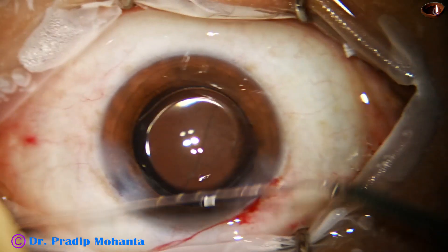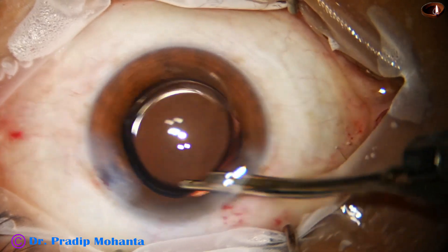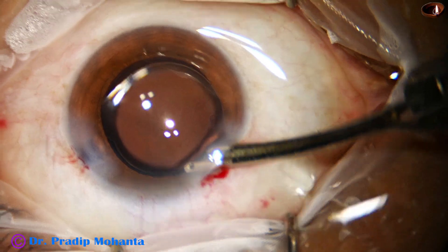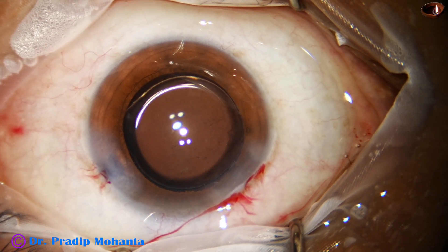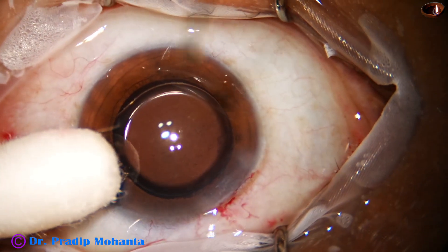The main wound has been hydrated in such a way that it will not require any suture for its closure. This is the final lavage. The anterior chamber has been formed. Integrity of the wound is checked — see, there is no leak.